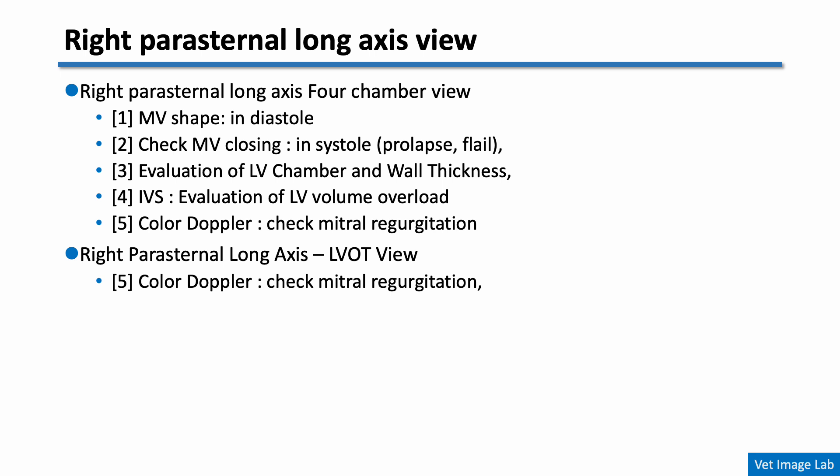Moving to the right parasternal short axis view: at the papillary muscle level, we assess the symmetry of the left ventricular shape and uniform contraction. Then we perform M-mode evaluation — by measuring the left ventricular diastolic dimension we can assess left ventricular enlargement, and by measuring the left ventricular systolic dimension and fractional shortening, we can estimate left ventricular systolic function. Finally, at the aortic valve level, we calculate the left atrium to aortic root ratio — this measurement is essential for detecting left atrial enlargement, a key indicator of MMVD disease progression.